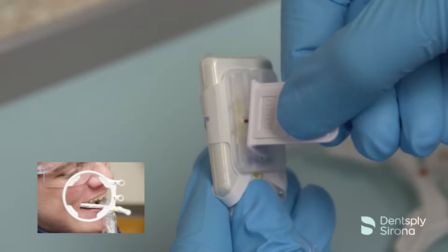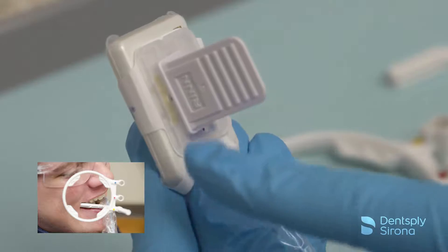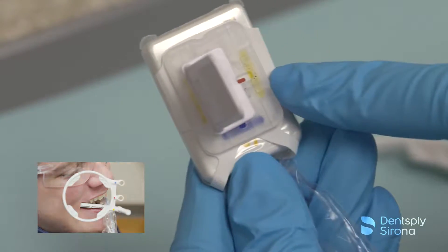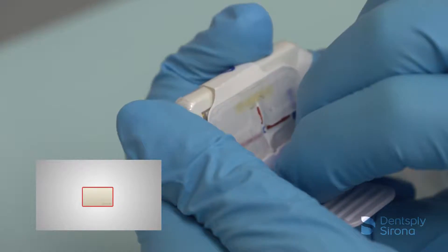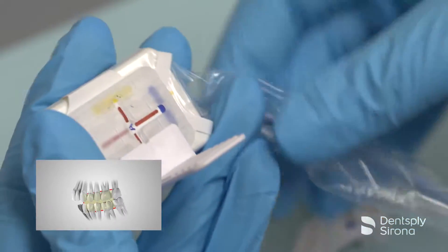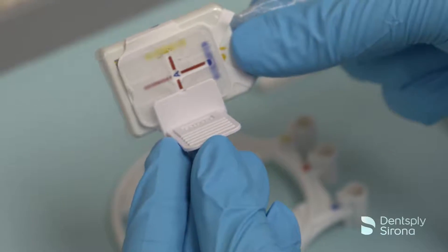For posterior images, slide the bite piece into the desired position as indicated by the yellow lines. Center the bite piece with the sensor's active area. The bite piece allows for a wide range of adjustment as needed to accommodate the patient's presentation.